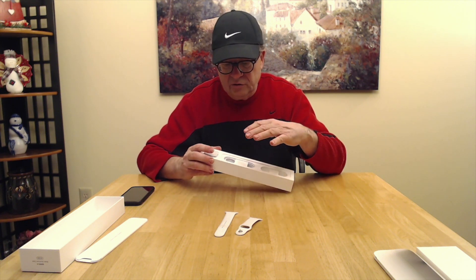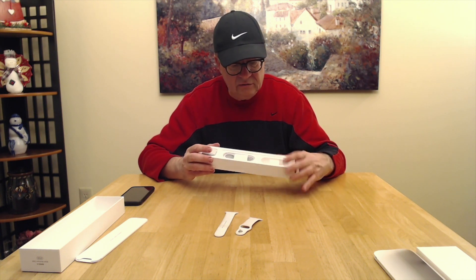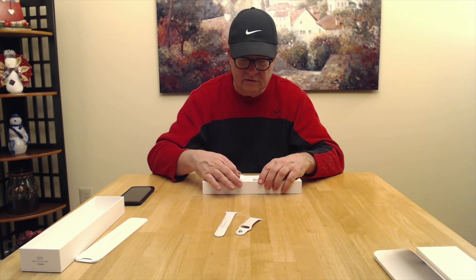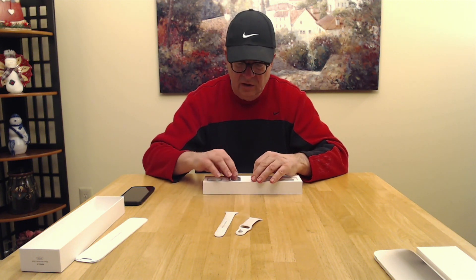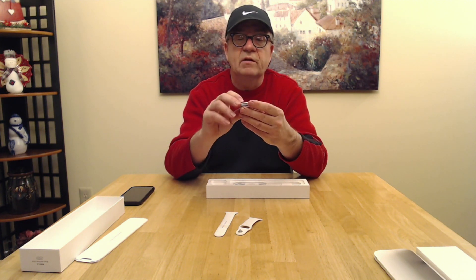Here's your charging brick, here's your USB connector to the port and to the watch, and you get this little fancy charging puck where you lay the watch down on at night or whenever you need charging. We're going to leave that in there for now.